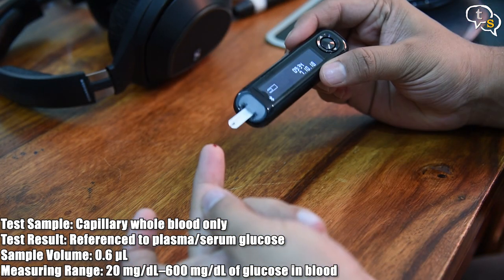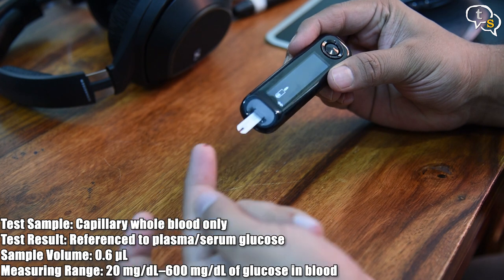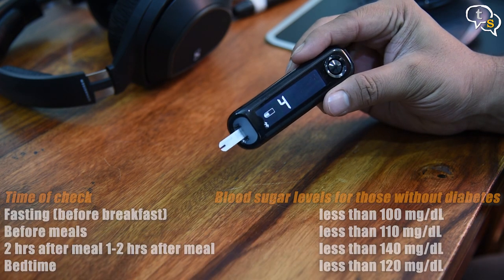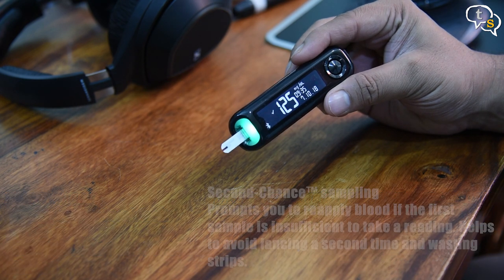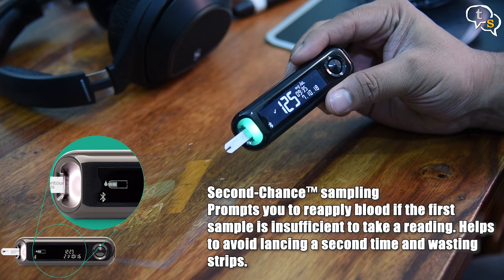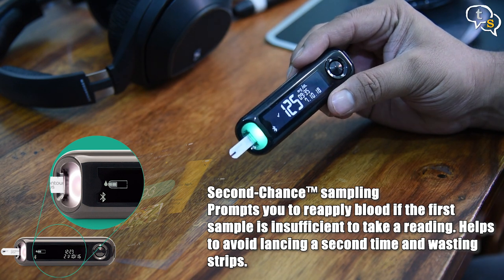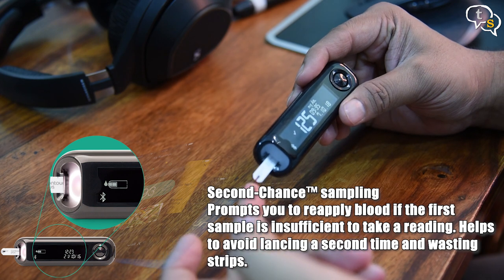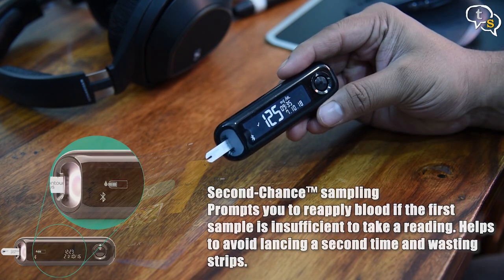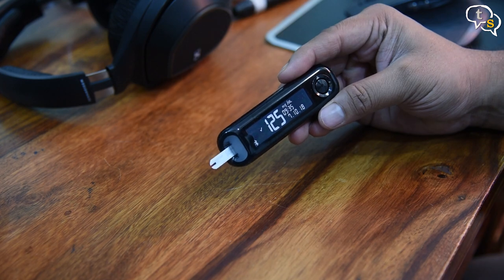Just touch the end of the strip to the droplet and due to capillarity, the blood sample gets drawn in. After 5 seconds, it displays the reading. If there's not enough blood, it displays on screen 'not enough sample' and allows for taking another sample without having to waste the test strip, which is quite nice as these test strips are not cheap — though the Bayer Contour test strips were not that expensive either.